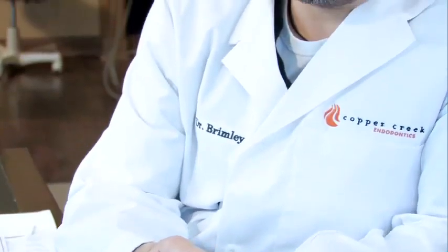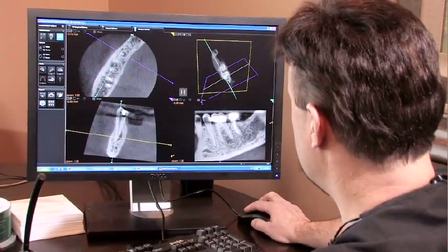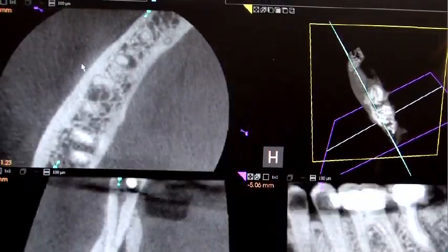Yeah, the advantage of being able to show a patient a three-dimensional image of their tooth and what's going to be required in their treatment is that the things that we have to do as specialists are usually treat curved canals or canals that are placed in different locations than they're normally found. And being able to look at a three-dimensional picture of that tooth, they're able to understand where curves are happening and why the case becomes so difficult.